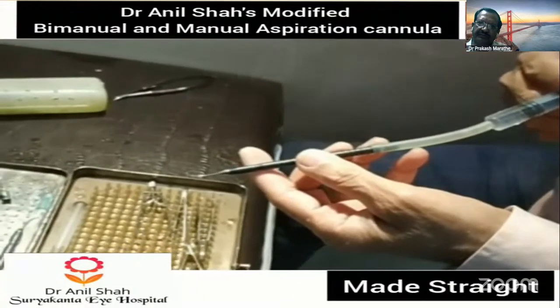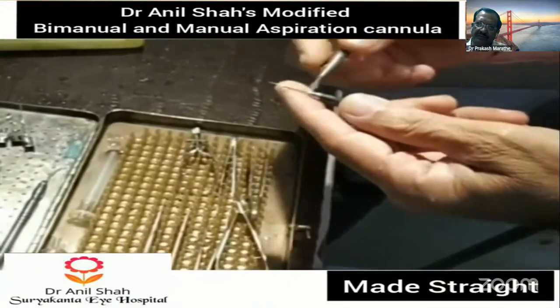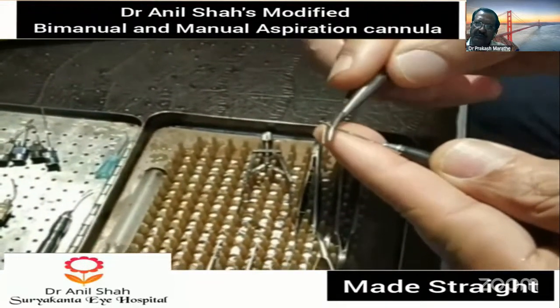This is a normal aspiration cannula with the tip facing upward. Now with the needle holder, the tip is made straight.